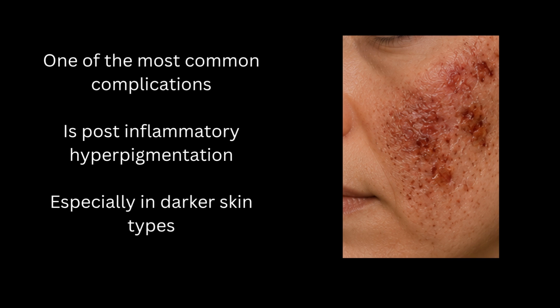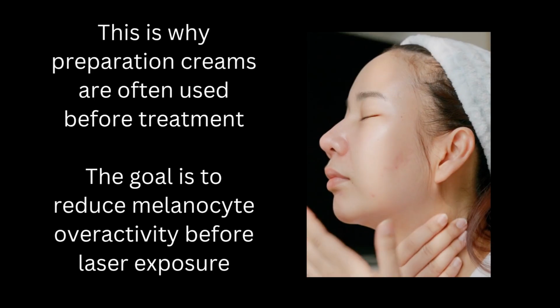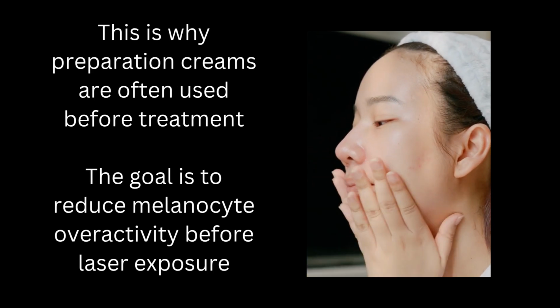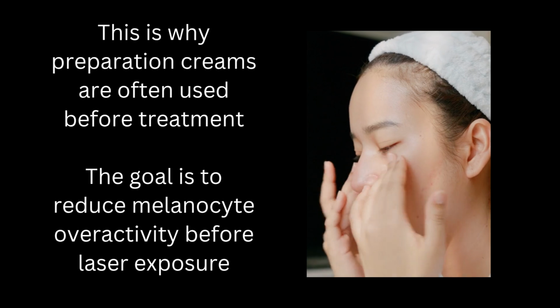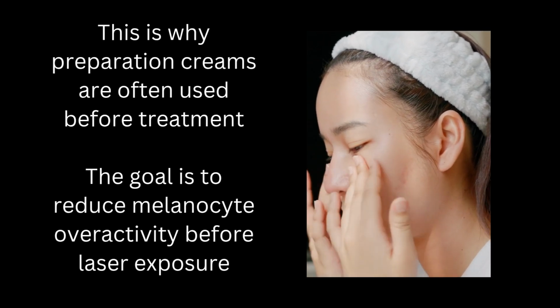One of the most common complications is post-inflammatory hyperpigmentation, especially in darker skin types. Inflammation stimulates melanocytes. The more inflammation generated, the higher the pigmentation risk. This is why preparation creams are often used before treatment. The goal is to reduce melanocyte overactivity before laser exposure.